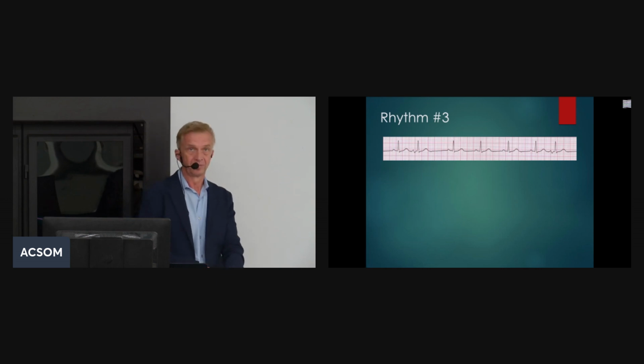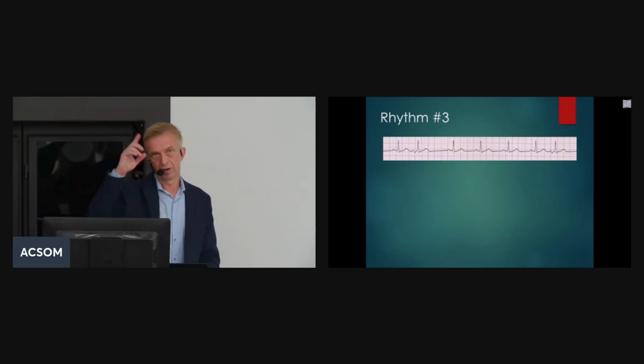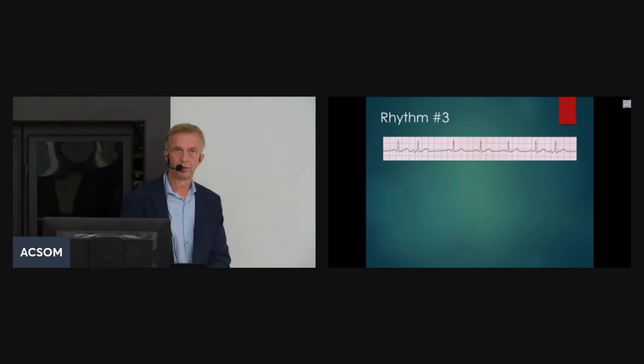That's one thing, yes. Because the ventricular contraction originates in the ventricle, the QRS is wide, right? There is a different morphology of the QRS complex, a different axis. It can go up or down. And also, because it originates in the ventricle, there is no P wave, right? What about the premature atrial contraction? This is the PAC, where you can see the normal size and normal morphology of the QRS complex, like in a normal sinus beat. But it comes a little bit earlier.